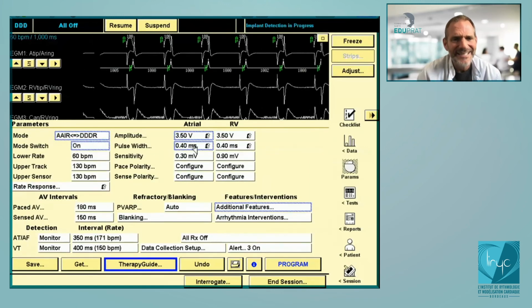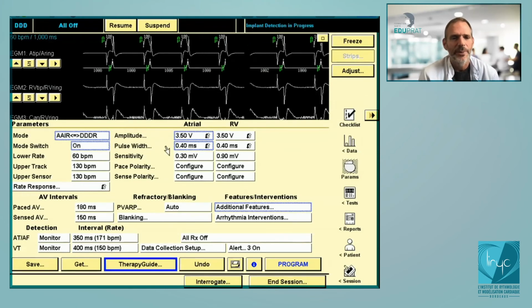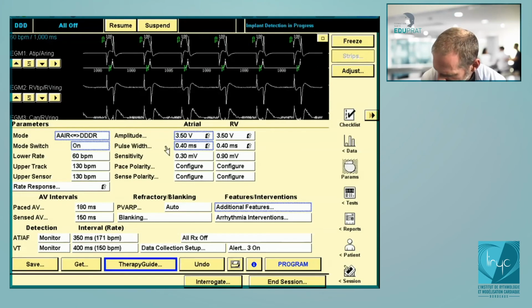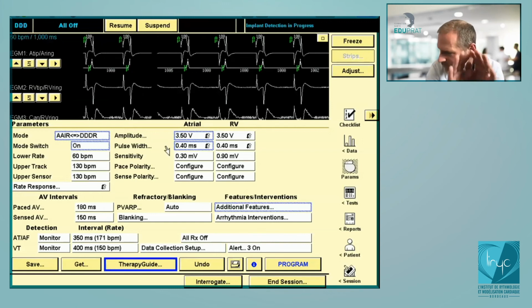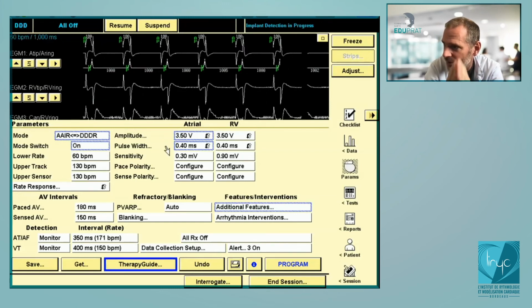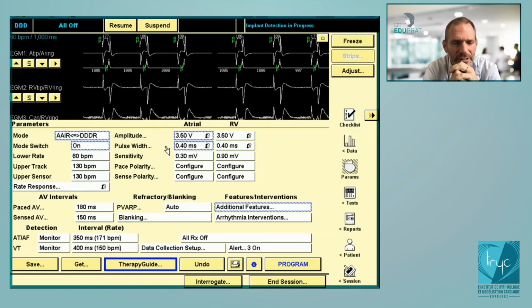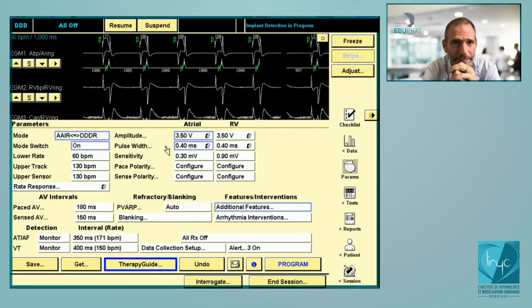So as I said, I'm not a big fan of the adaptive inside the atrium, but for the sensing, I systematically program bipolar, and it means that it will work like an ICD. Another parameter that will change is if you click on PVARP.